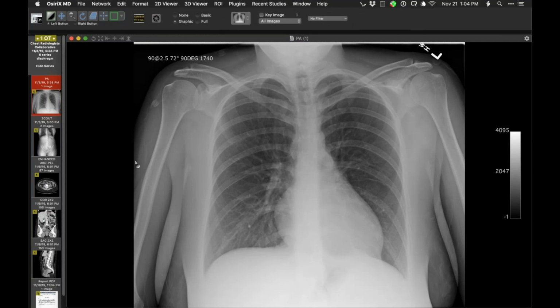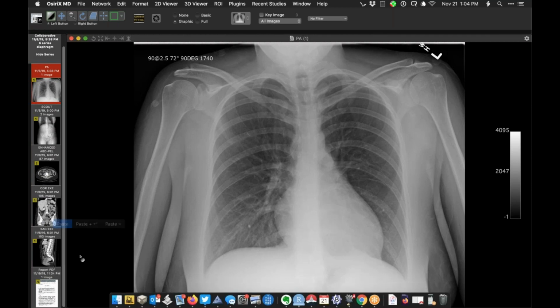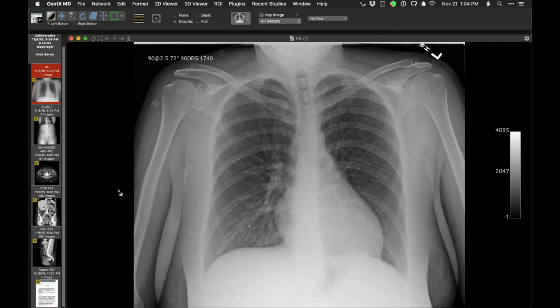So this is going to be a cause of pancreatitis that is not on your differential diagnosis list as an etiology for sure. You'll see the presentation in a moment, but apparently this patient did present with upper abdominal pain acutely, and her lipase level was high, and I'll show you that in a moment.